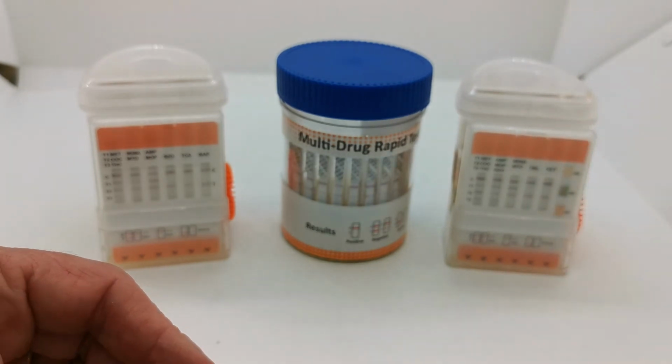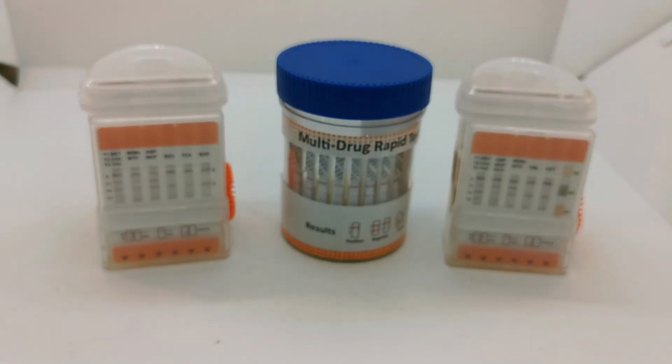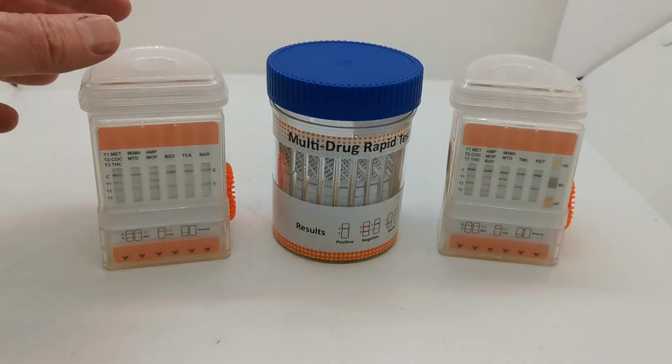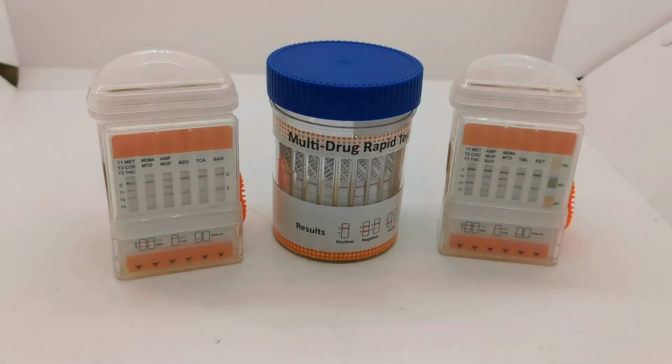So I hope we've clarified that for you. You can't draw any useful information from the thinness, thickness or colour density of a test line on a drug test. I know these examples are for urine tests, but the same goes for saliva lateral flow drug tests as well.